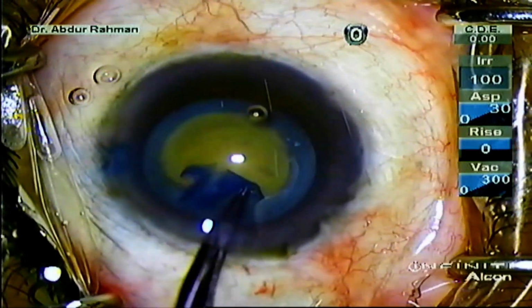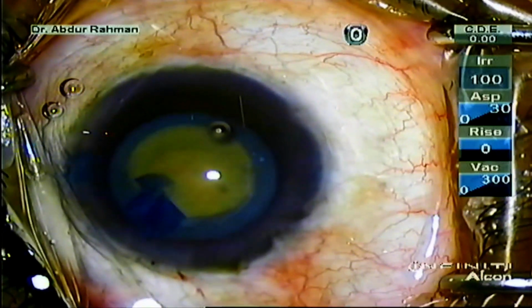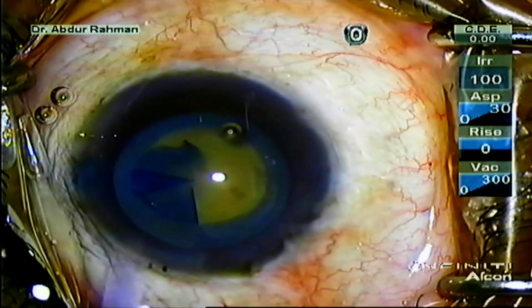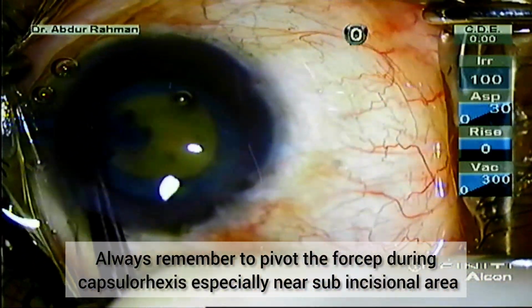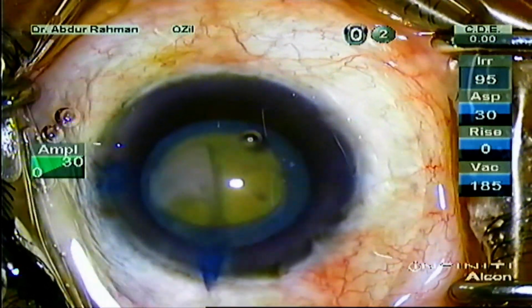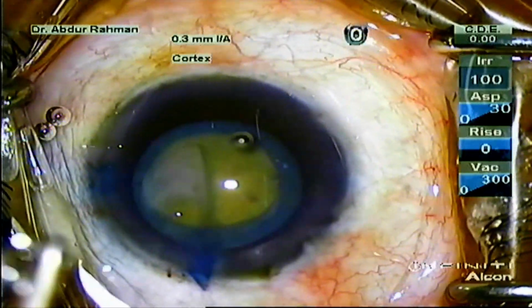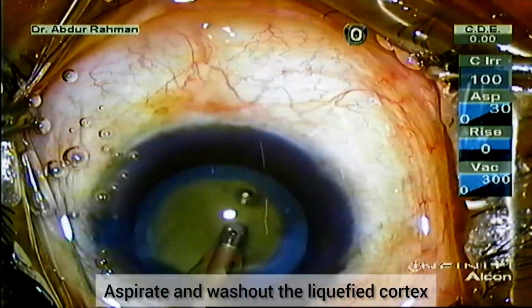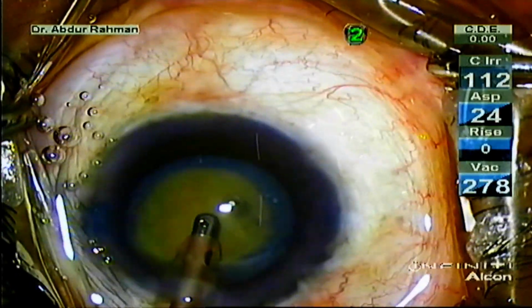With the rhexis holding forceps, always remember to pivot in the incision while making the rhexis. Yes, I have completed a beautiful circular continuous curvilinear capsulorhexis of about 5 mm in size. With the coaxial I/A handpiece, I am washing out and aspirating the liquefied cortex.